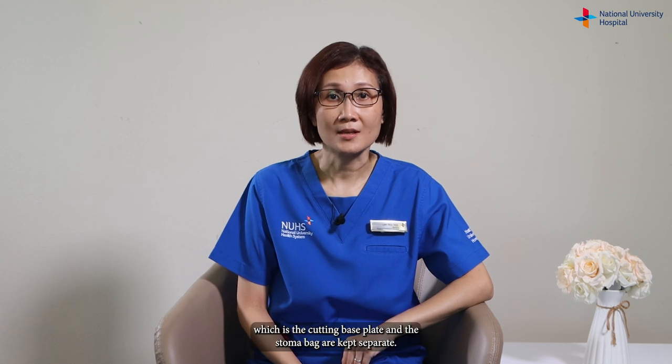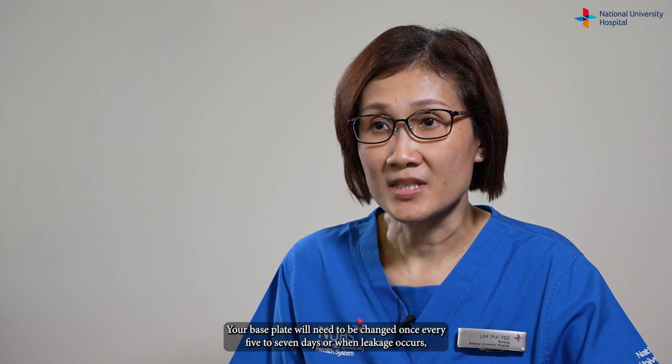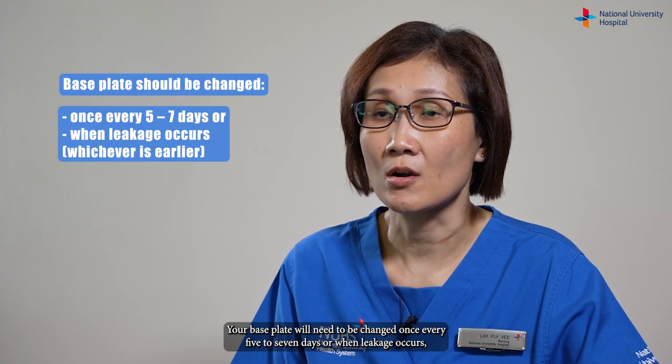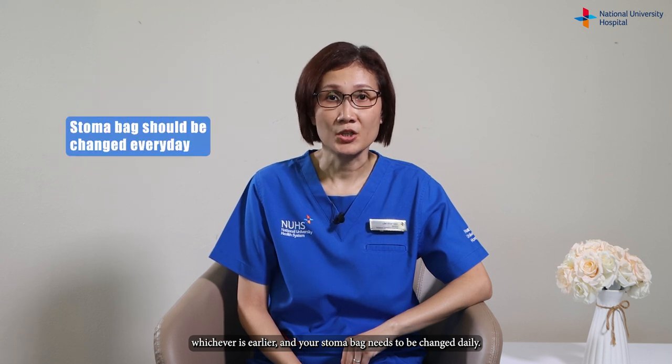It is called a two-piece system as the skin barrier, which is the cutting base plate, and the stoma bag are kept separate. Your base plate will need to be changed once every five to seven days or when leakage occurs, whichever is earlier, and your stoma bag needs to be changed daily.